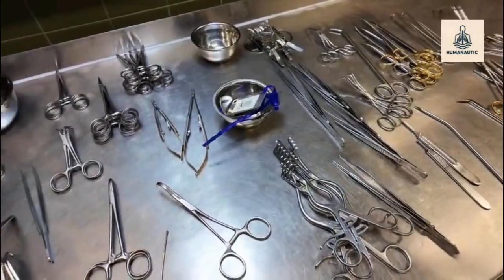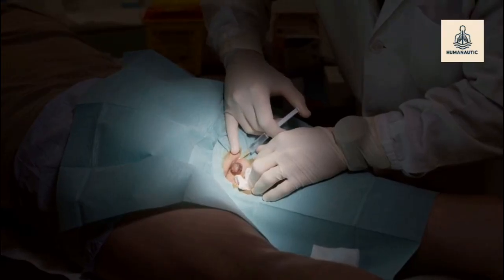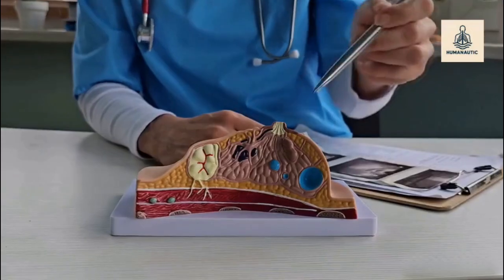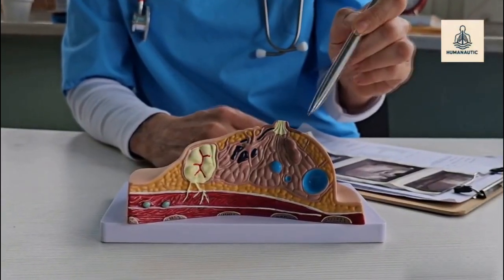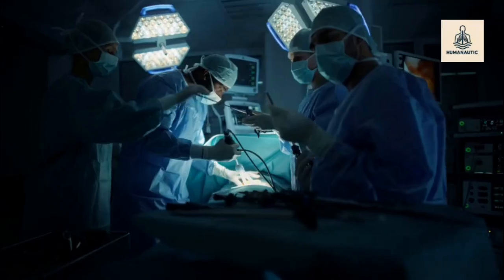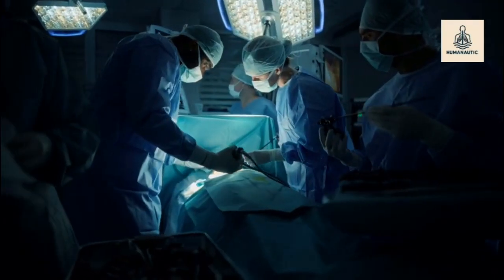Separating the breast tissue. Next, the surgeon carefully develops the surgical plane between the breast tissue and the overlying skin. The breast tissue is gradually separated from the skin and underlying structures. The dissection continues toward the chest wall, where the breast tissue is separated from the pectoral fascia. The surgeon works carefully to control bleeding while preserving structures that do not need to be removed.